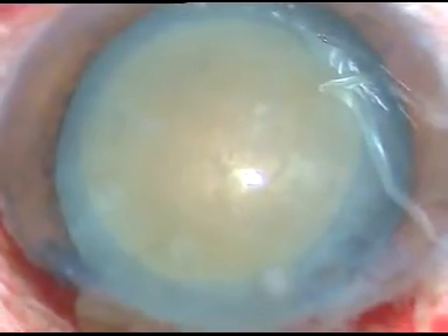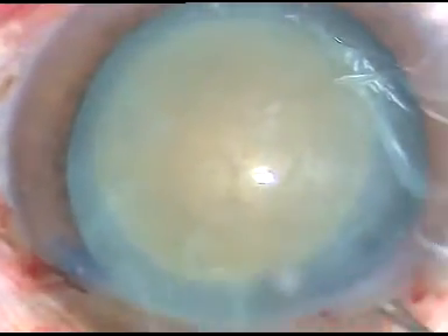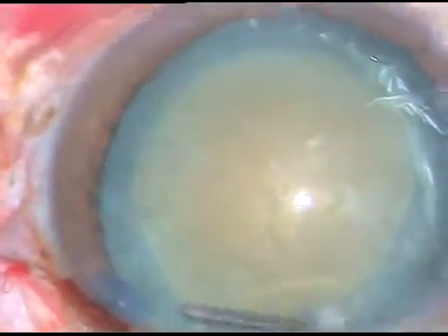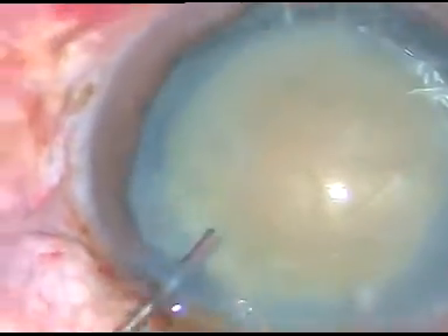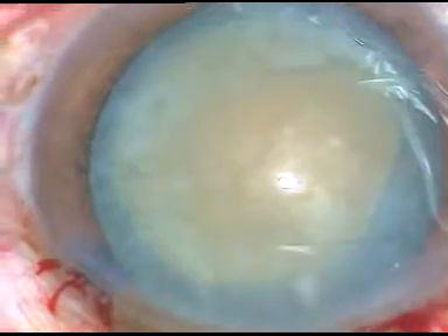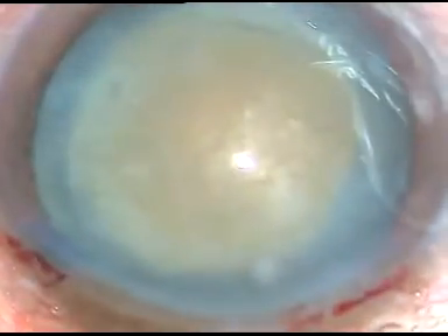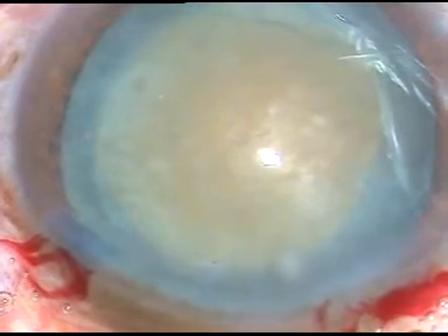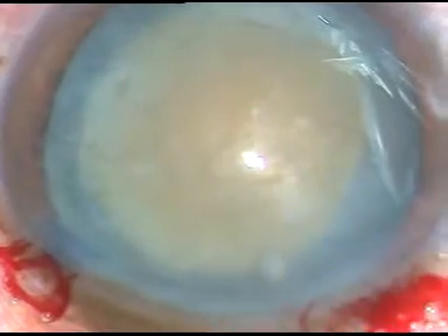We can see that this cataract is not very soft — it is grade 3 plus or grade 4, let us say grade 3 plus. In this case I am going to do a direct chop. HPMC has been injected into the anterior chamber, and I am going to use the phaco machine in this case.